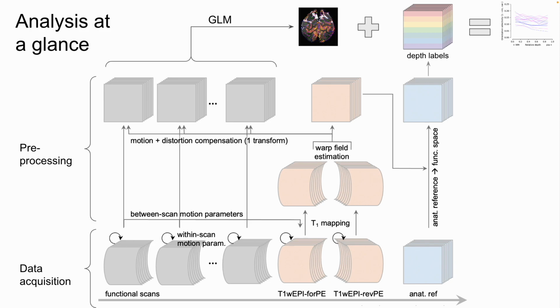This was a special pulse sequence that we had to create, after I tried 6 other things and fell flat on my face. I seriously spent a year trying to figure out how to add adequate T1 weighting to my own EPIs, and it completely failed until I read Camille Uludog's paper and other people created this pulse sequence for me.